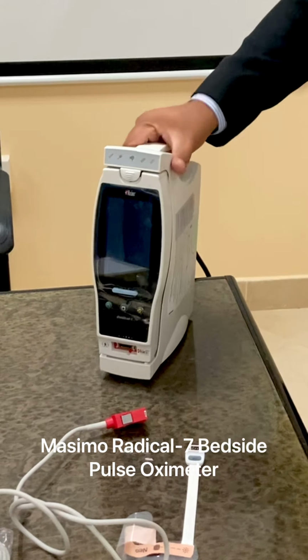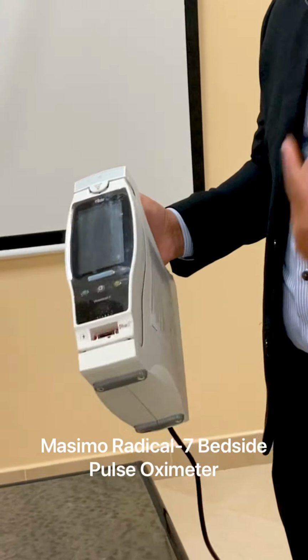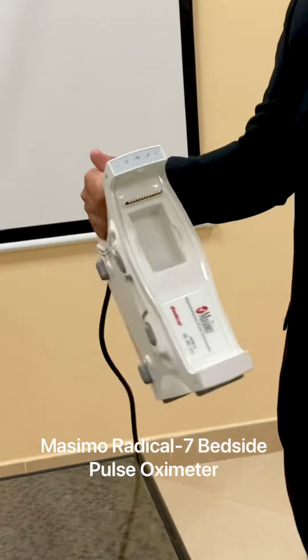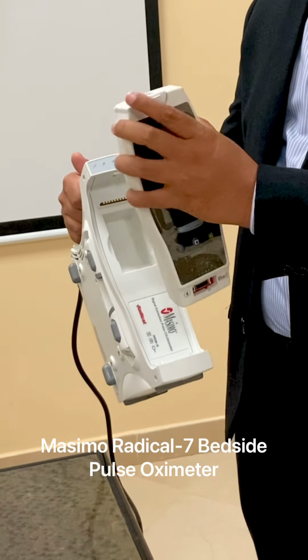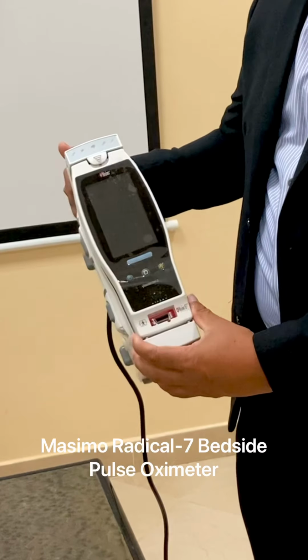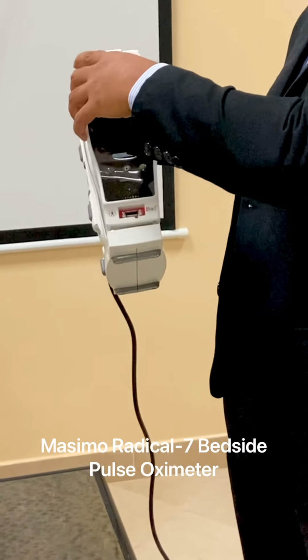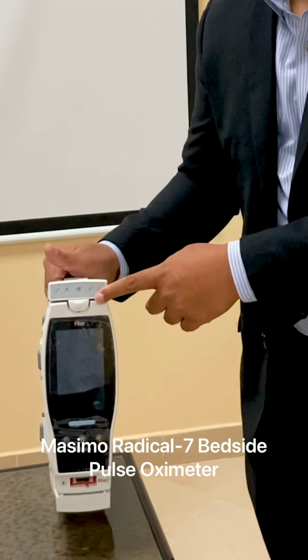The next thing is the hardware. It has four parts. The first one is the docking station. This is the docking station for charging the device, and this is the actual module, which calculates and displays SpO2. Then we connect it here for charging. This is how we are connecting. You first need to install the base here properly, and then put it inside. You'll hear a big sound, and that means it's already locked.